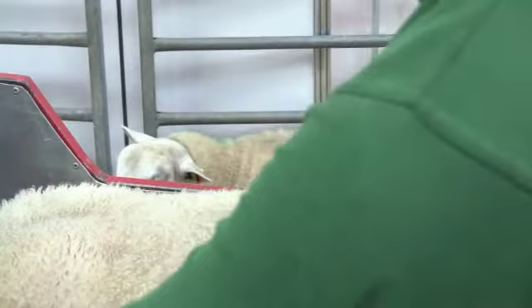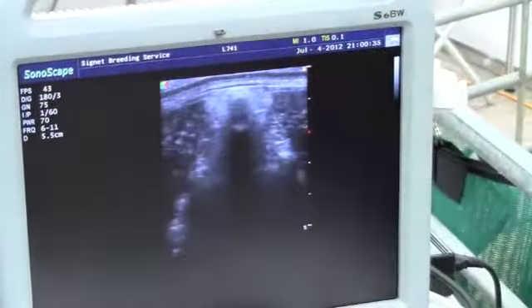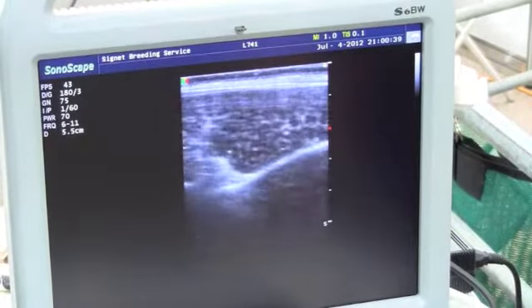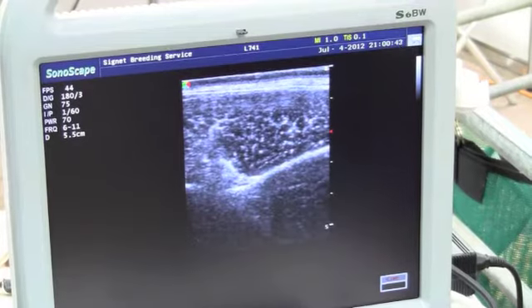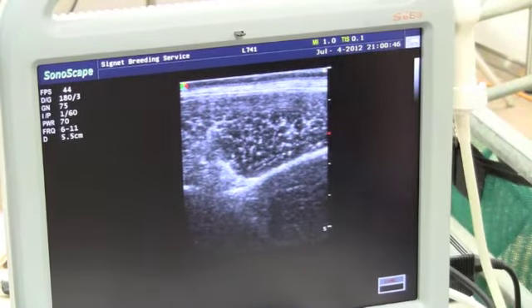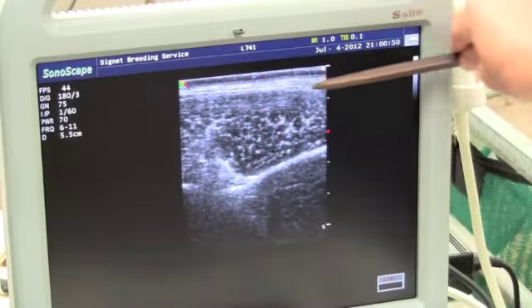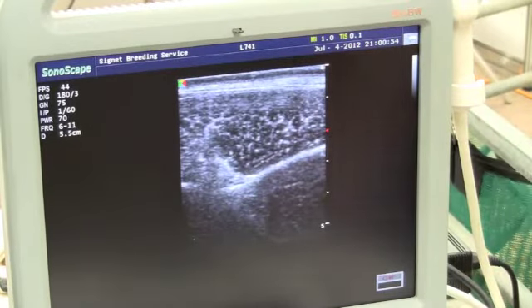With the ultrasound scanner we first of all find out where we are — the skin is at the top of the screen. We slide over to one side and we find the loin chop, which is the eye muscle that we're going to measure. This black area here. The fat layer runs across the top, the bone down the bottom, the muscle in the middle.